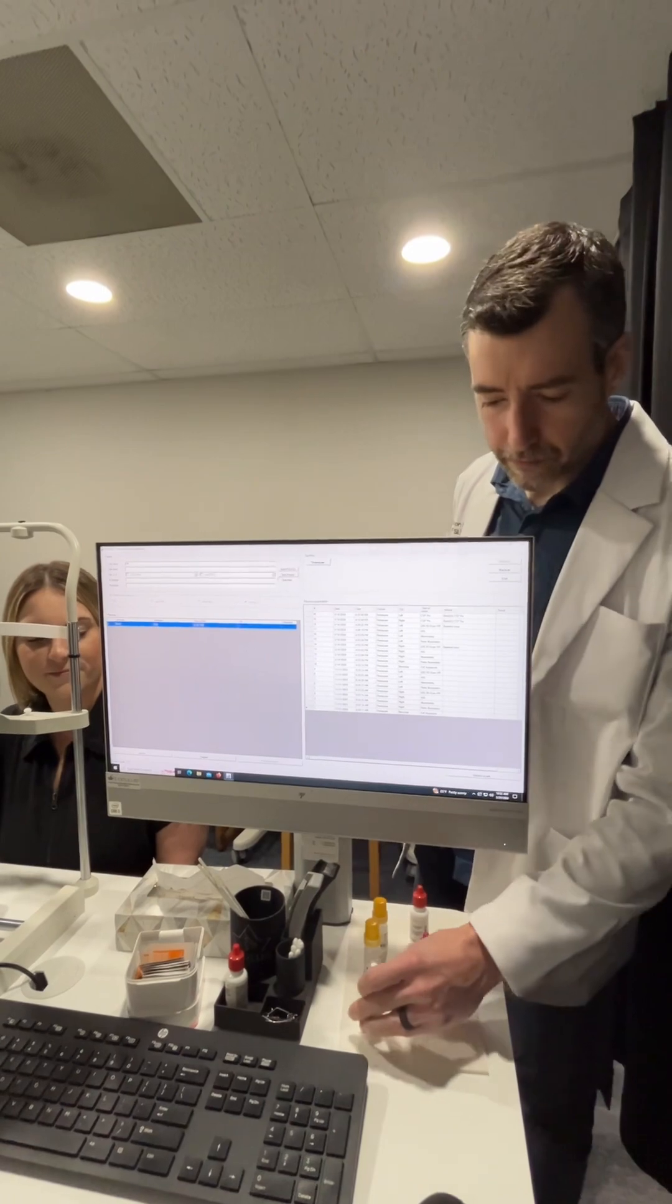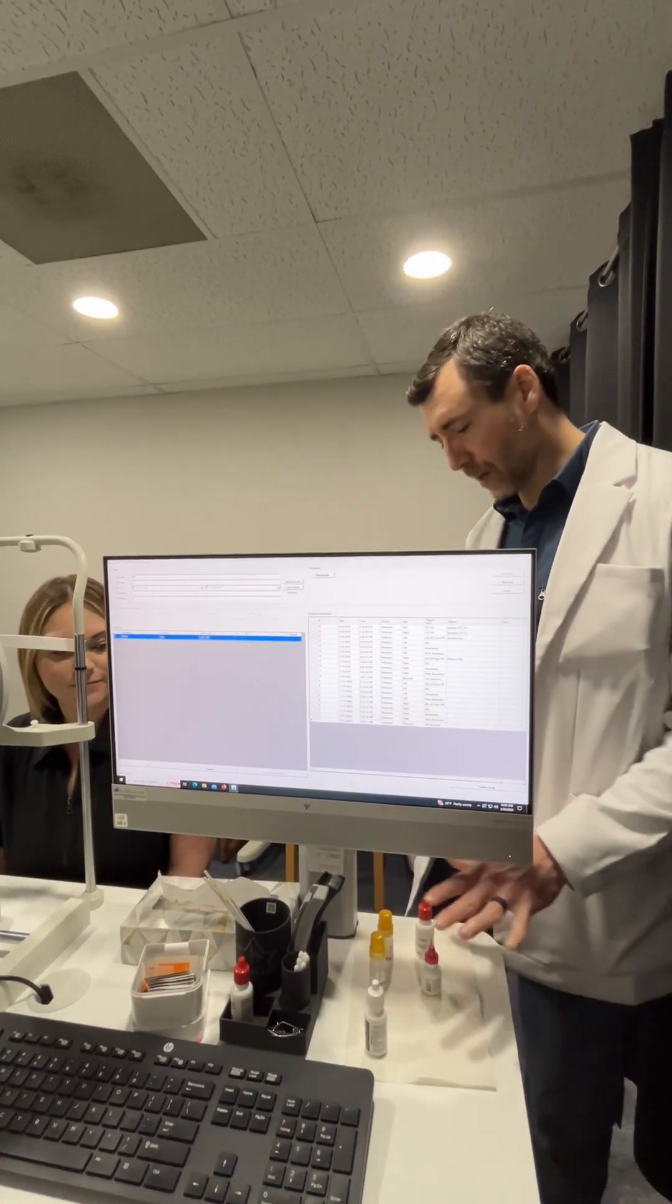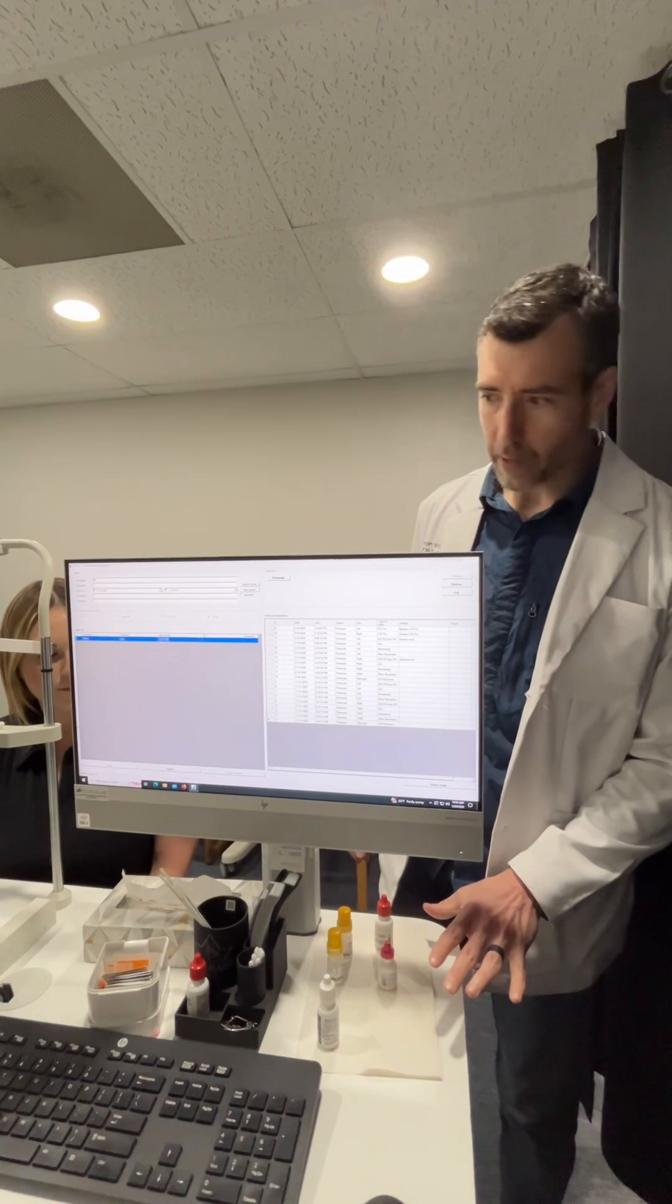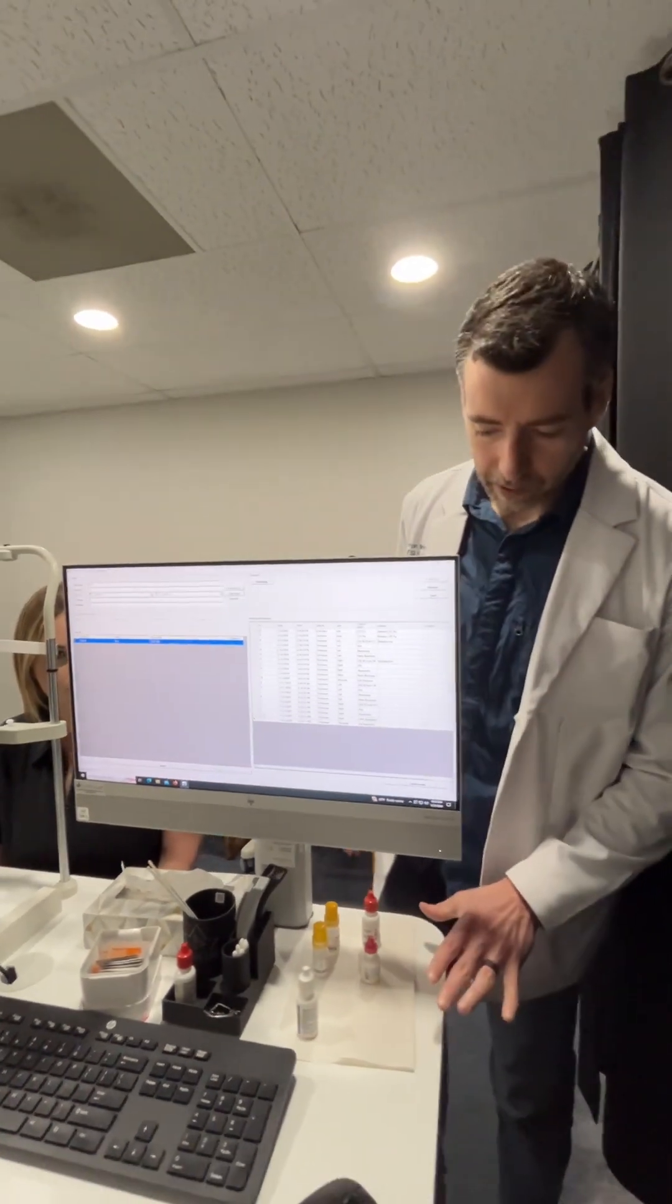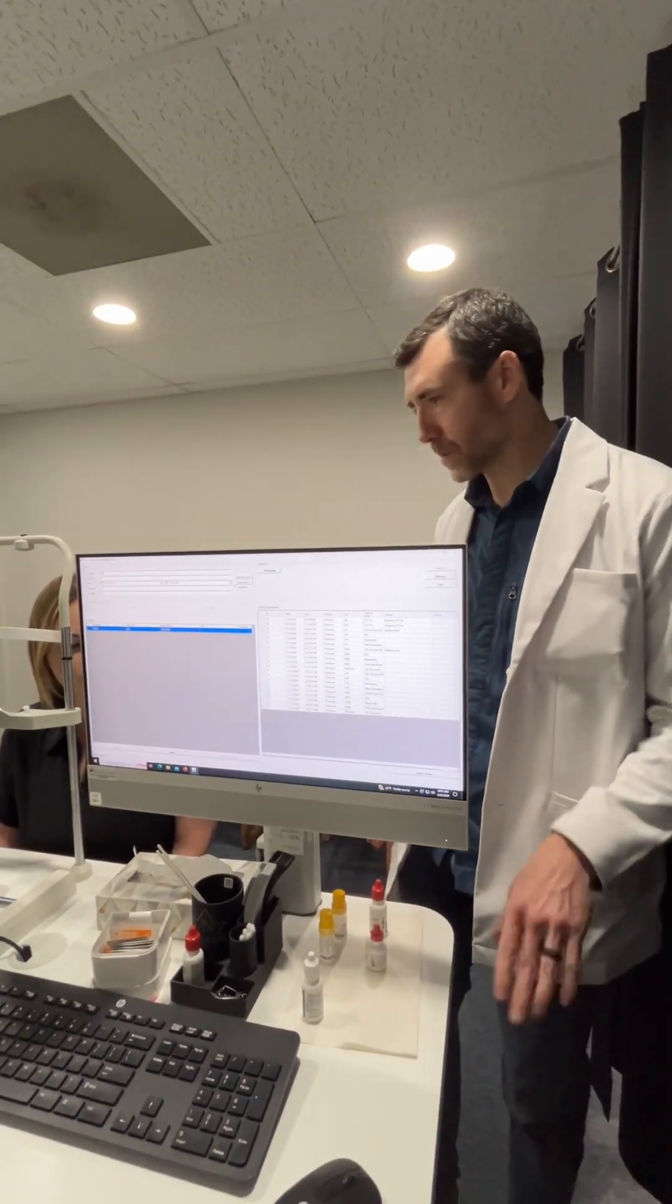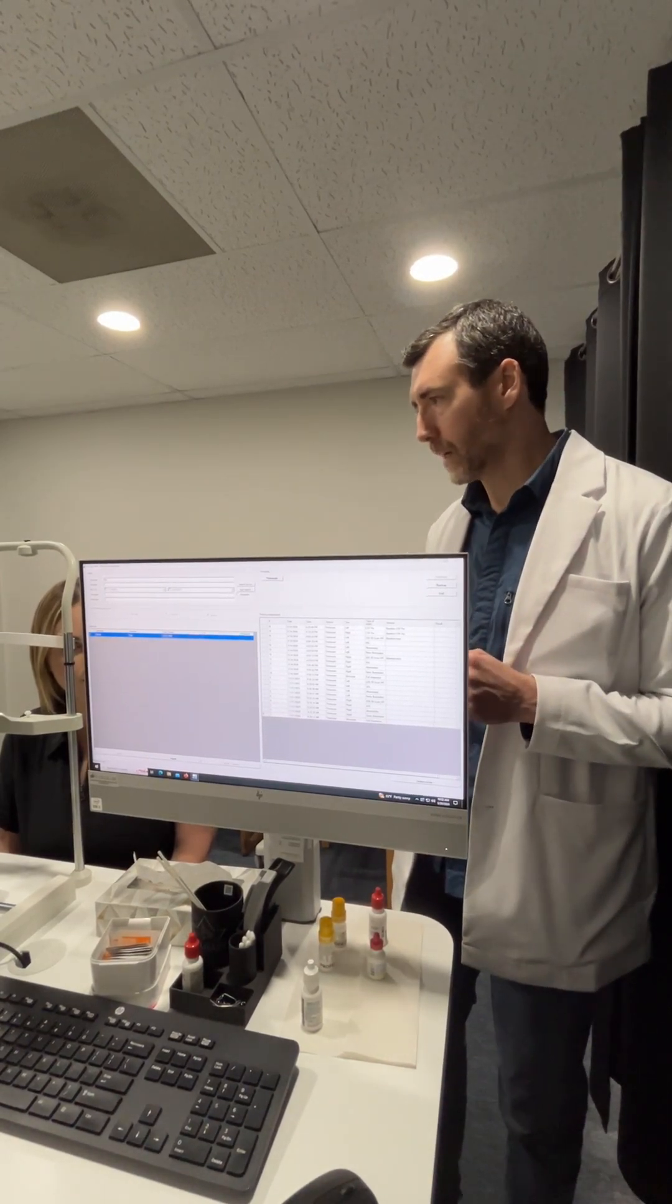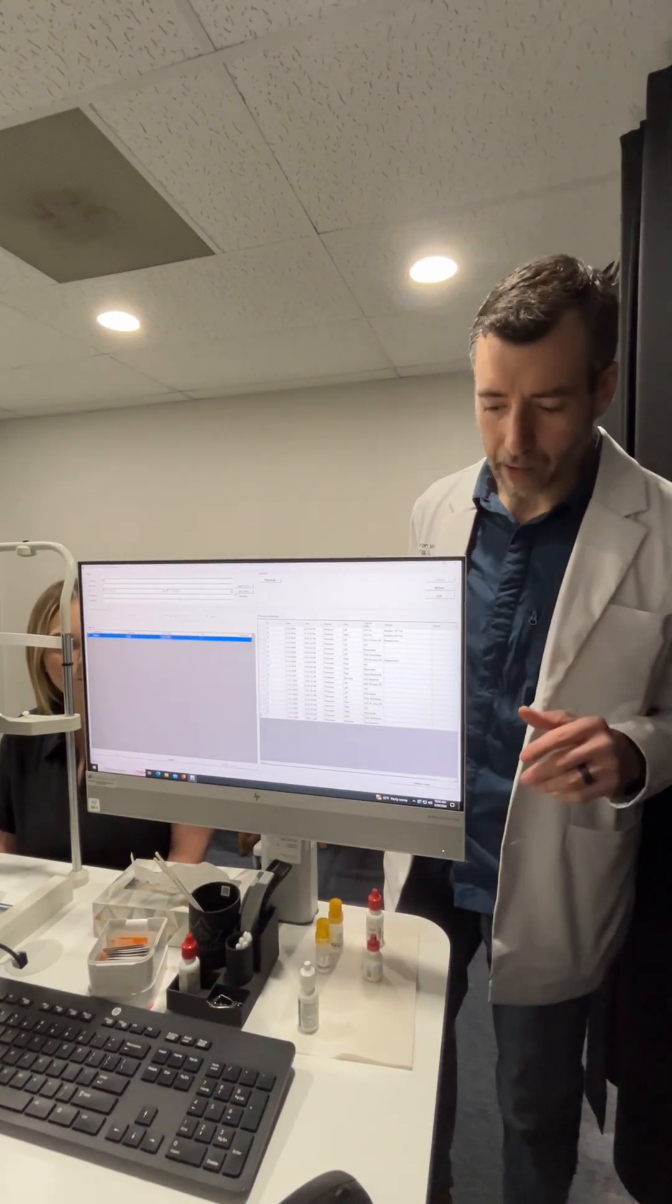We have drops over here that we use for various things. Sometimes we need to dilate to get a better cataract evaluation, lubricant drops sometimes when we hold the eyelids really wide open for corneal maps or scleral maps.